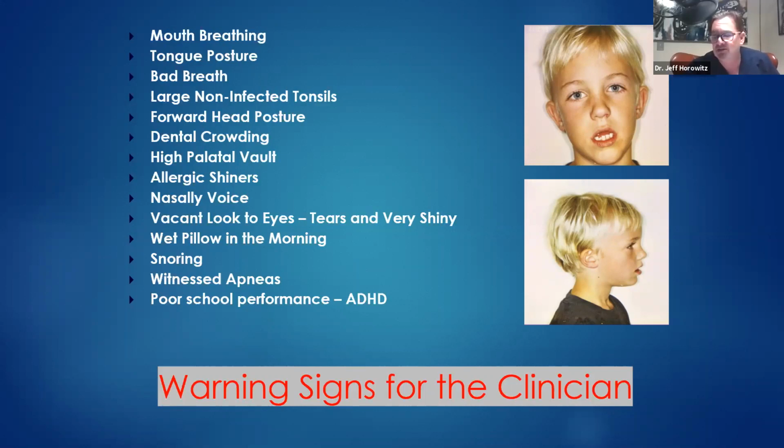You bet you I do, because not only can I evaluate the tonsils, the adenoids, I can look at their growth and development. I'm getting a panoramic image. It becomes my pre-orthodontic image because I can develop a cephalometric analysis just based on the one scan if it's taken in a large field of view. You betcha I'm going to do that. And there's not going to be a need for a lot of other intraoral x-rays. And I can show you where over the course of 5 years, I will subject that child to less radiation, having taken just that one scan, and then using other tools for the diagnosis of caries.